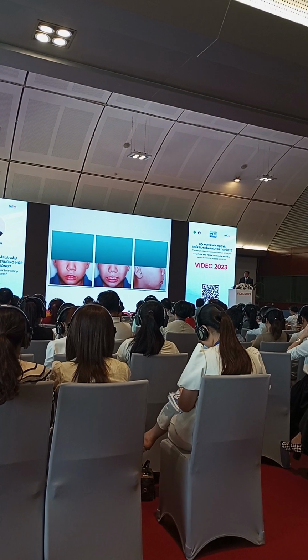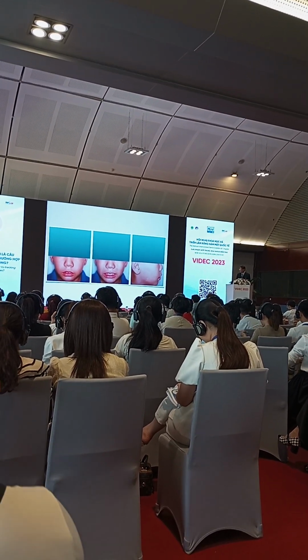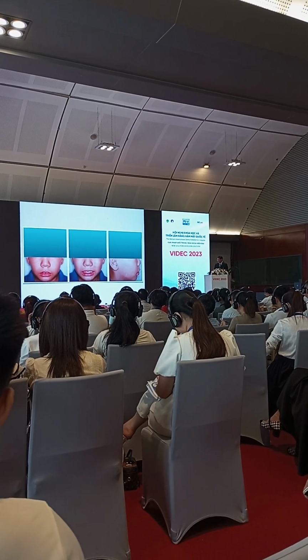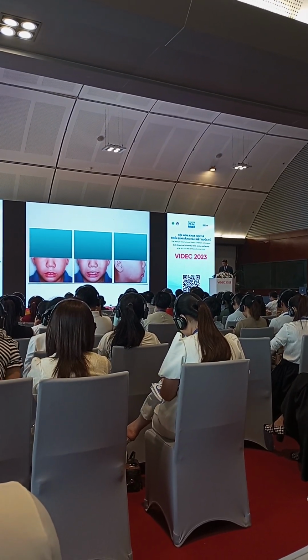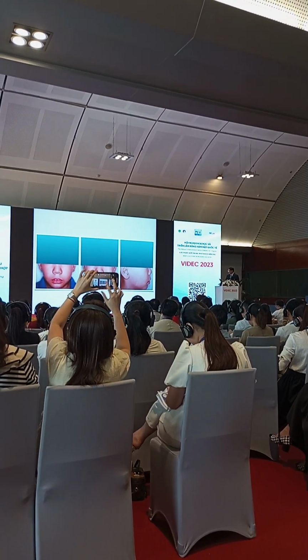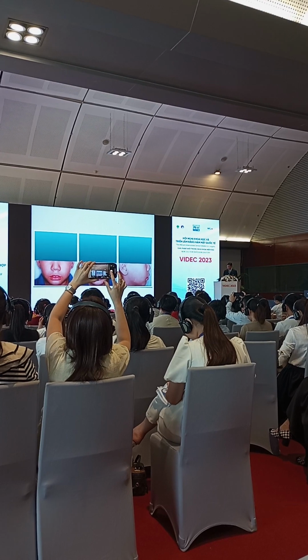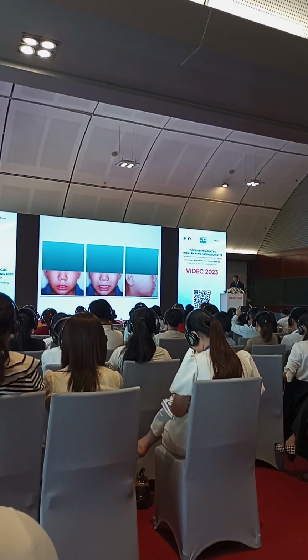So this is the pre-treatment picture from the previous dentist. The patient was still very young when he underwent orthodontic treatment. So you can see a typical type of mixed dentition stage profile.